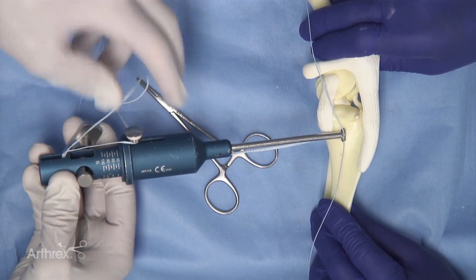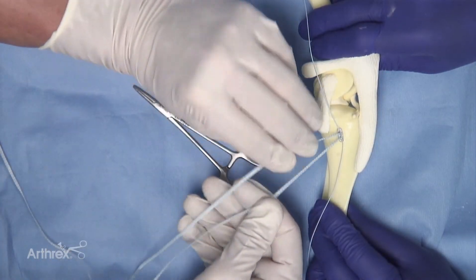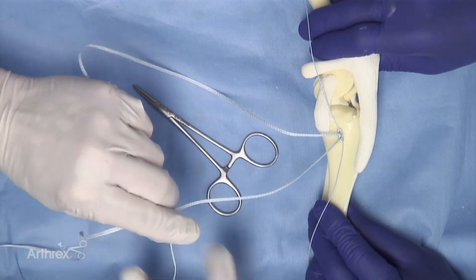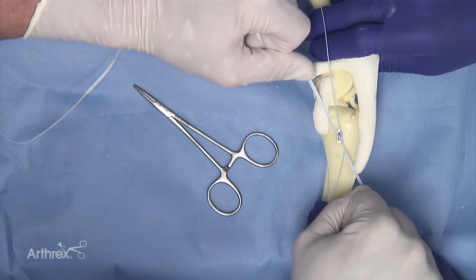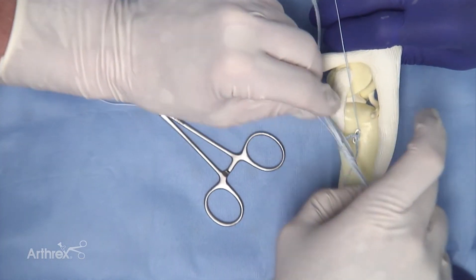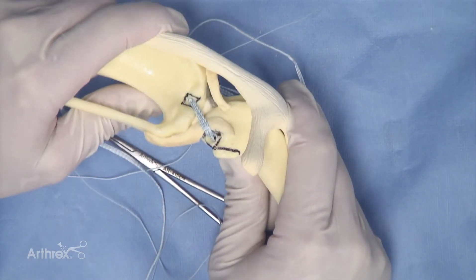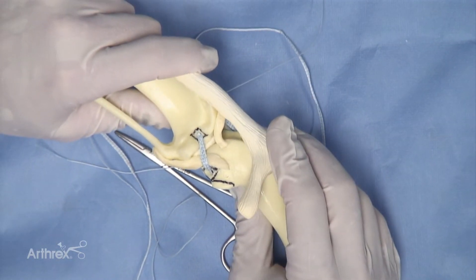If satisfied, disengage the fiber tape from the tensometer and perform the initial tying of the fiber tape. Single throws and square knots are preferred. It is possible to re-test by placing a bow on the initial throw and then testing to make sure that drawer motion and instability has been resolved.